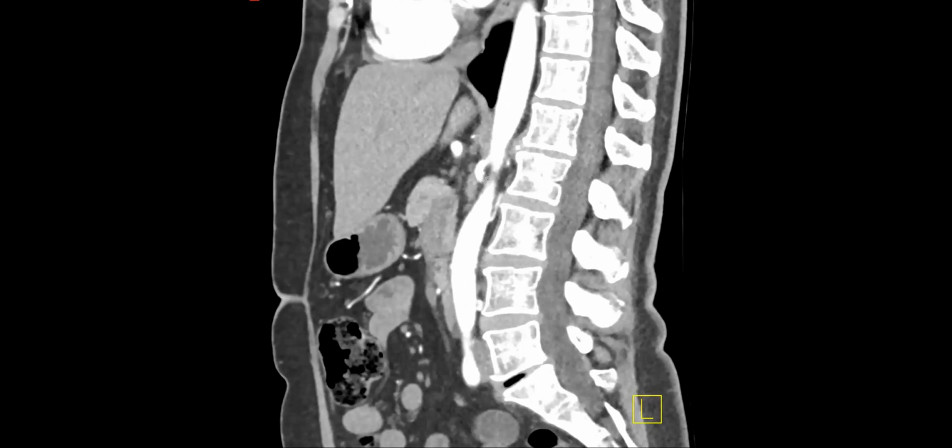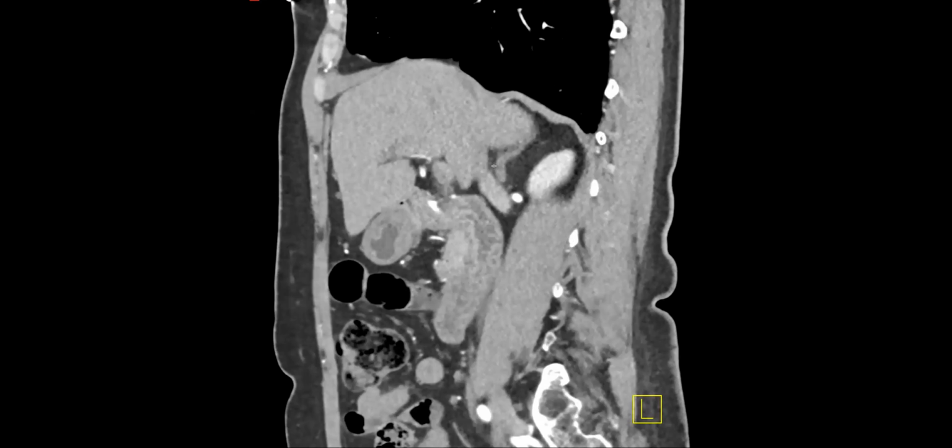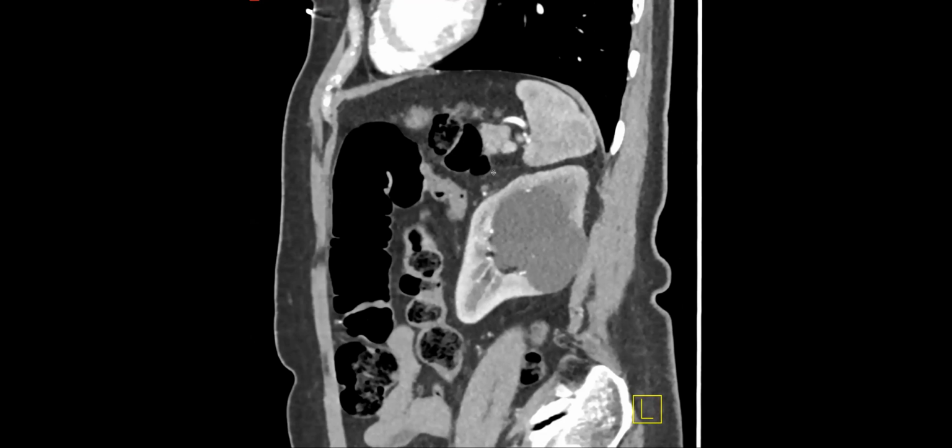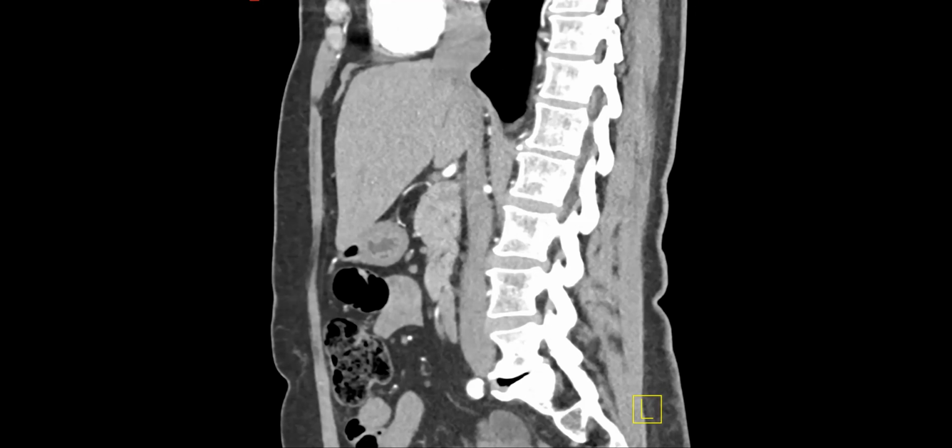The sad thing in this case is that Fraley syndrome is probably going to prevent this person from being a donor. It may, yeah. Because I know that even if they have cysts and stuff, that can preclude. I think they have some criteria. So if they have focal hydro like that, I think they would probably not donate that. And usually they take the left kidney because it has a longer pedicle.